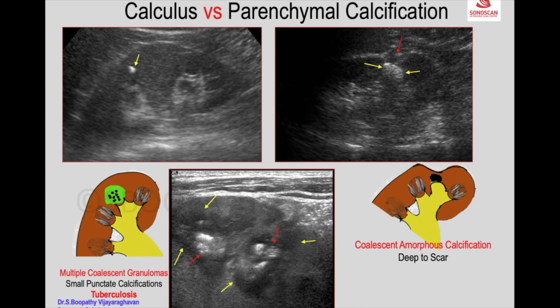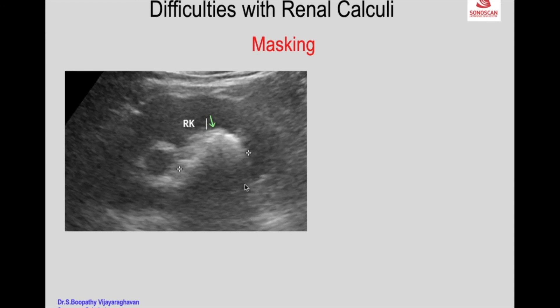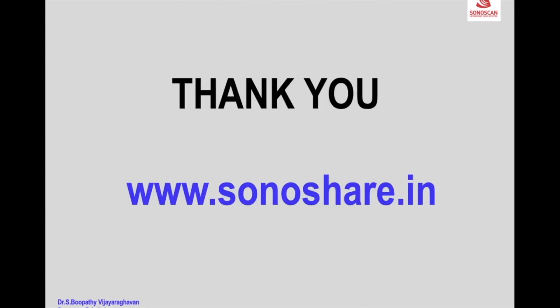Typically there is a superficial parenchymal scar, so this appearance is a sequela of calculus disease. When you do a transverse scan, the kidney looks normal, but you see a calculus medial to the kidney with shadowing. Something in this part of the renal parenchyma will be masked by the shadow — that is what has happened. There is a large calculus.